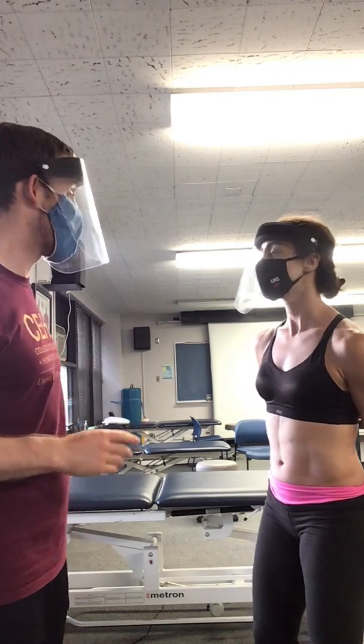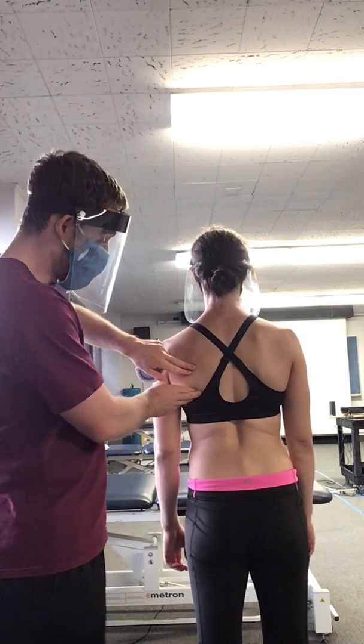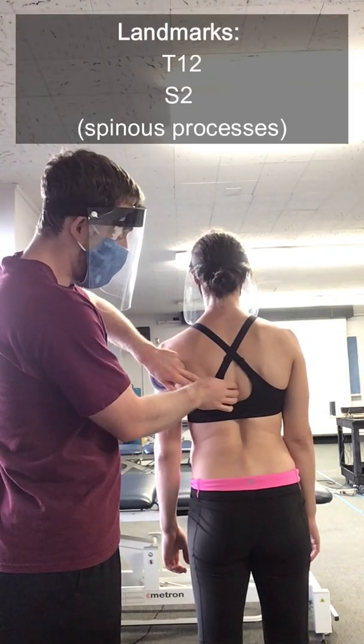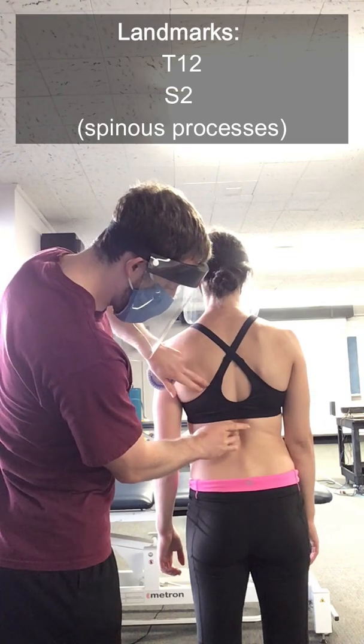Sounds good. All right, I'm going to have you face that way. And the first thing I'm going to do is find her T12 spinous processes. So I'm going to start at the inferior angle of the scapula — that's right at T7. I'm just going to go down one at a time: T8, T9, T10, T11, and T12 right over here.